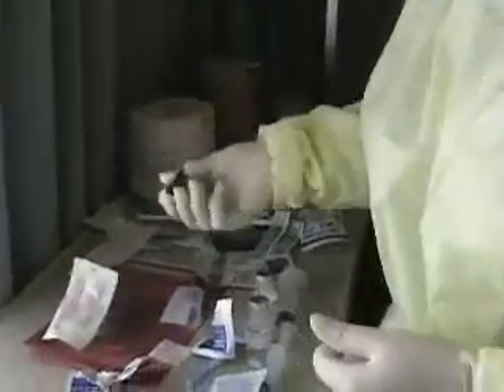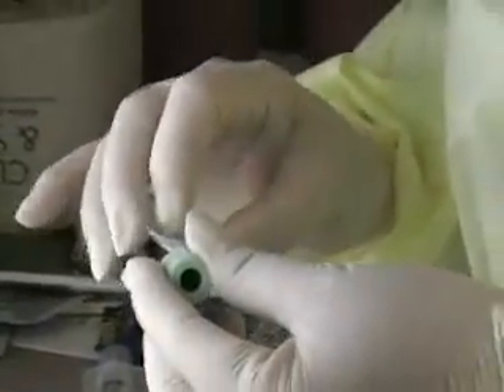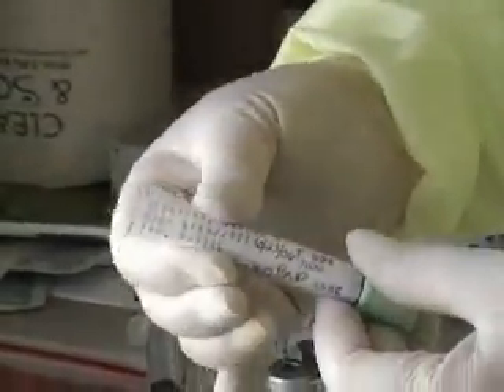Do we have the transfer equipment up on the units? Now we have our sample and we'll put our label on — the date and time, what the draw is for, the nurse's initials, and the patient's information.